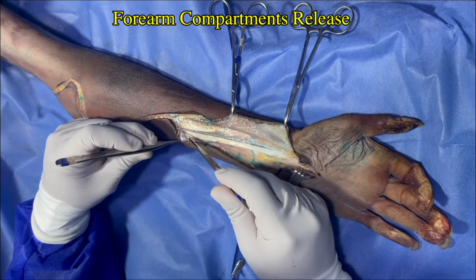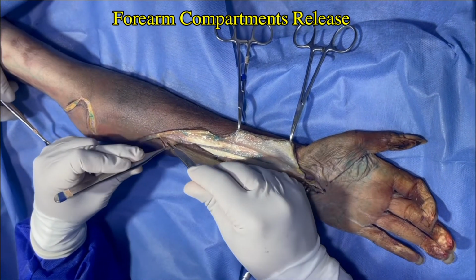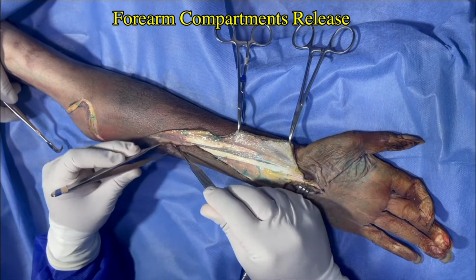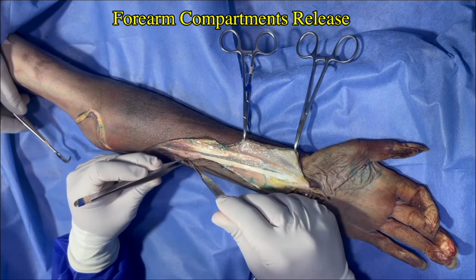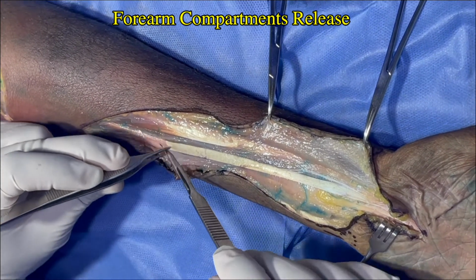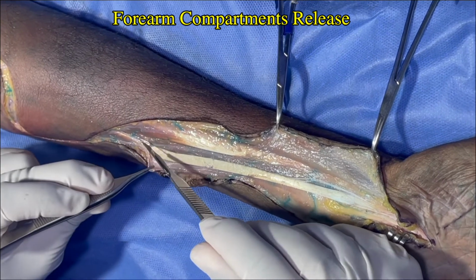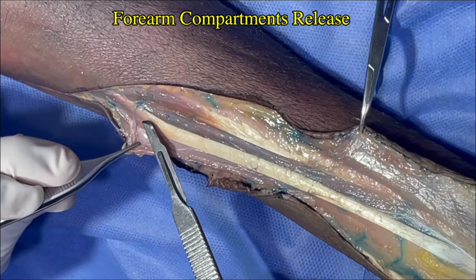We continue with the dissection of the ulnar skin flap perfused by the perforators of the ulnar artery, which need to be preserved as well as the perforators of the muscle bellies severely affected during compartment syndrome, and which will be responsible for reperfusion after the release of the ulnar artery.